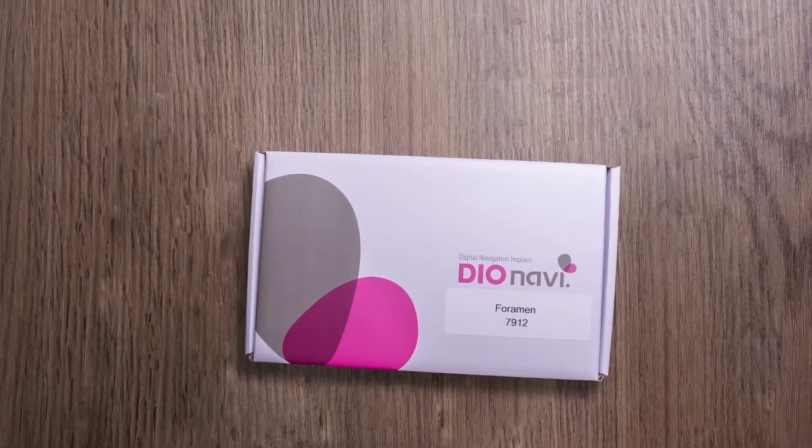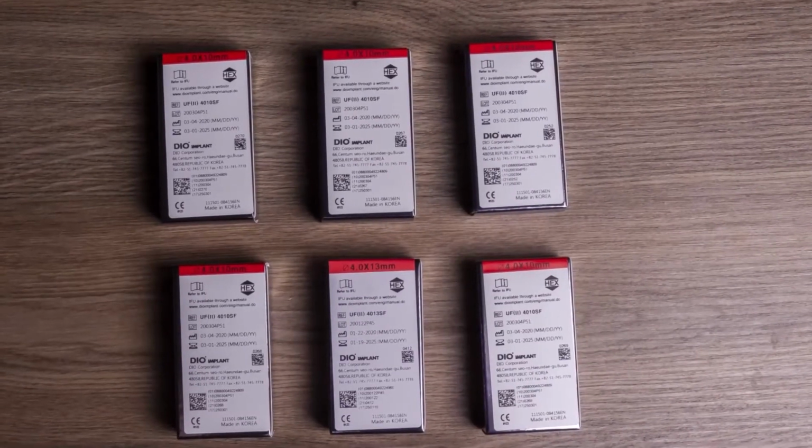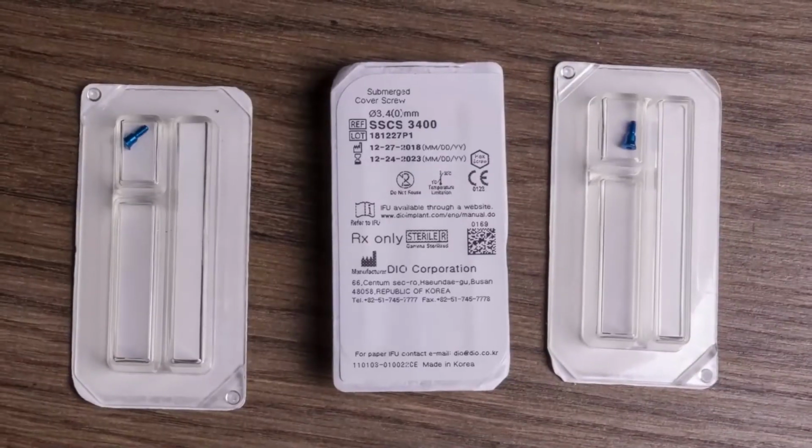Inside you will find a surgical protocol with a surgical sequence to be used, including the depth, diameter, and offset for each implant. You will also find a surgical report and a drilling protocol, that is, detailed documentation that will ensure you have all the adequate information to proceed with the surgery. Also inside are the planned implants, the guides themselves, the custom abutments, the teeth, and in the event that you don't want to load your implants immediately, the cover screws.